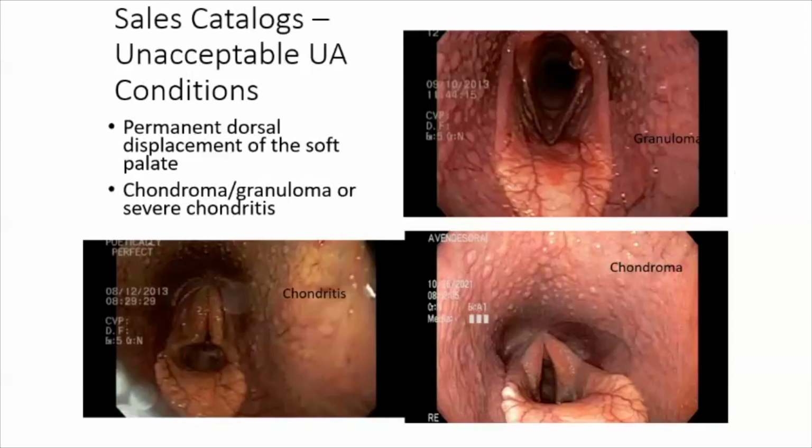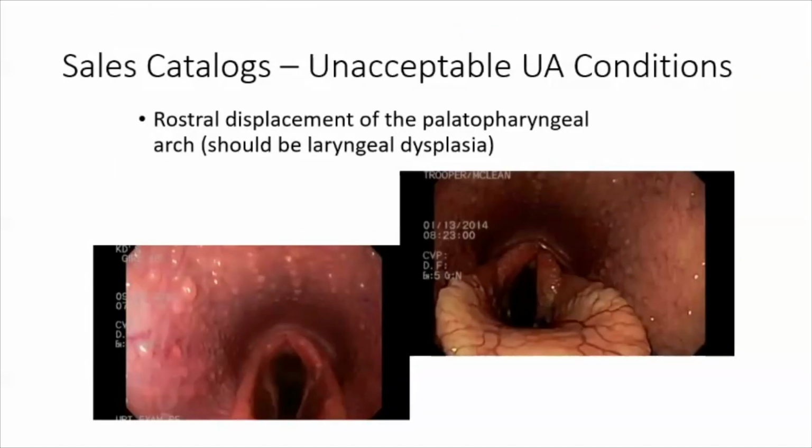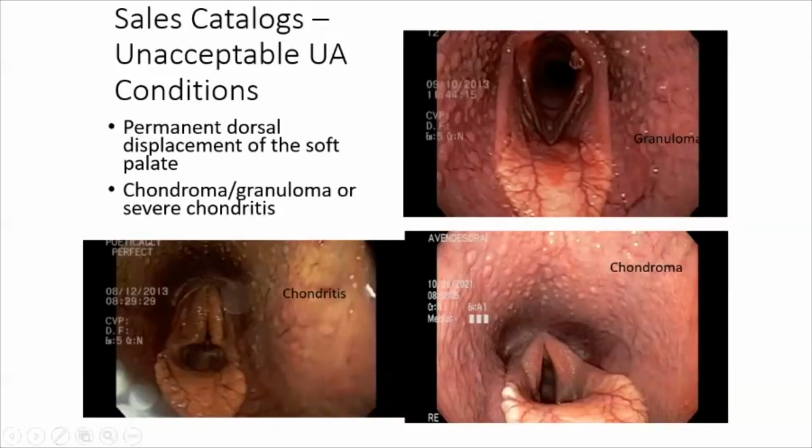Next. These unacceptable conditions, would they be rated like a grade 3 or 4 throat, or would this horse even be allowed in the sale? That horse wouldn't make it to the sale. Both those horses, those two images there, people would not have brought those to the sale. Okay. So a lot of these things get weeded out before the sale because they're scoped pre-sale to see if they're going to be okay in the sale. Right. Okay. But these two horses would not have made it. No. Very good. Okay. The next one.